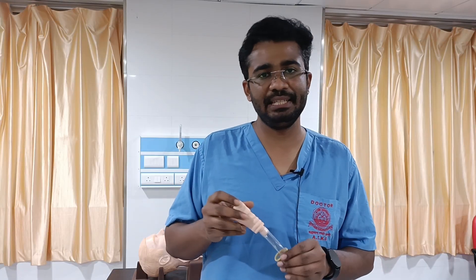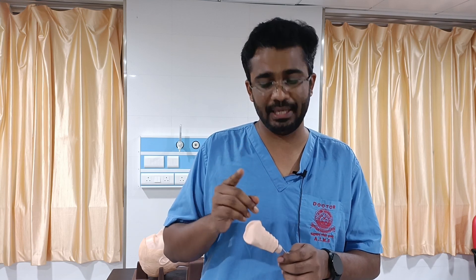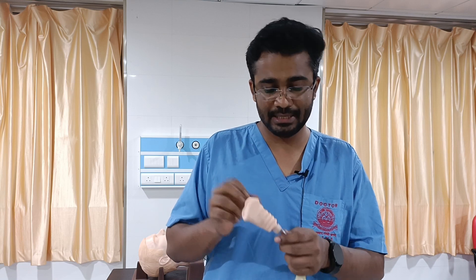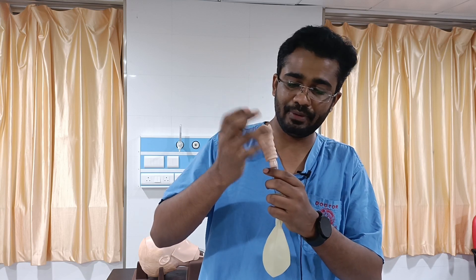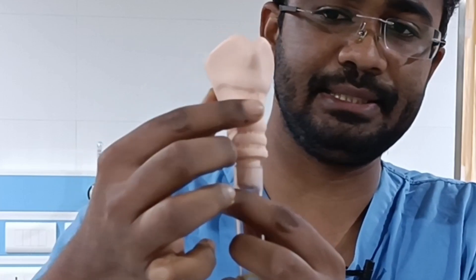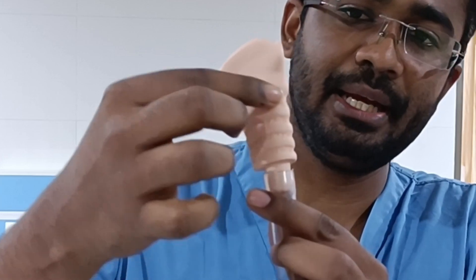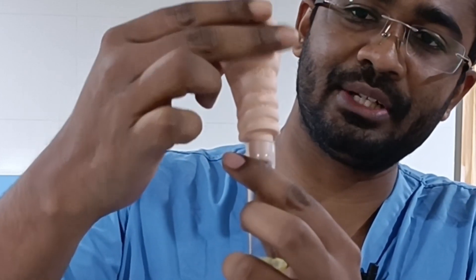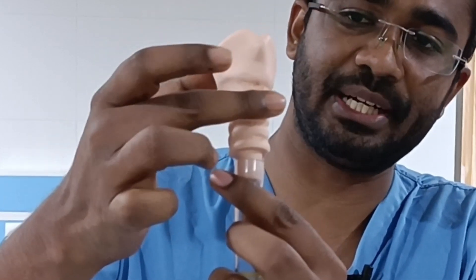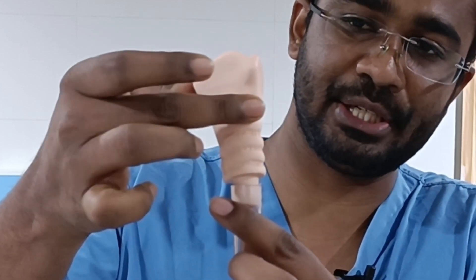For insertion of the needle we have a landmark. The landmark is the cricothyroid membrane, which is found between the thyroid cartilage and the cricoid cartilage. Going down from the Adam's apple we will find the cricothyroid membrane. When we pass our finger from the thyroid down to the cricoid cartilage there will be a depression in between — this is the cricothyroid membrane.